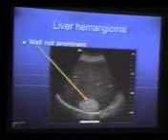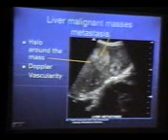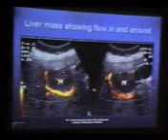This is a hemangioma with the feeding vessels here. The liver malignant masses have irregular shapes and have the peripheral halo around them, typical of metastatic lesions. Liver metastasis, halo around the malignant masses, and Doppler vascularity within and around.